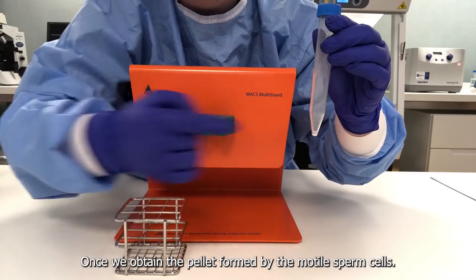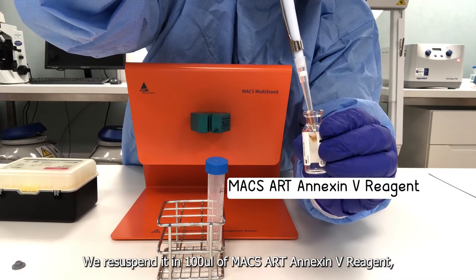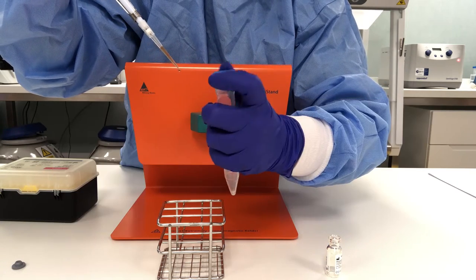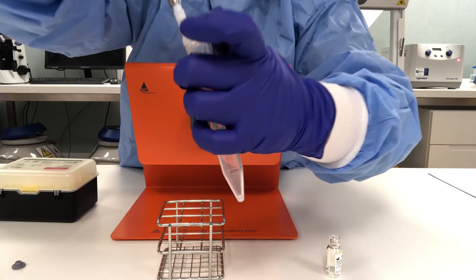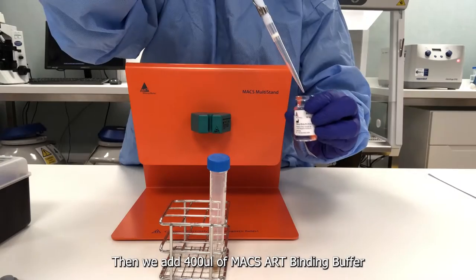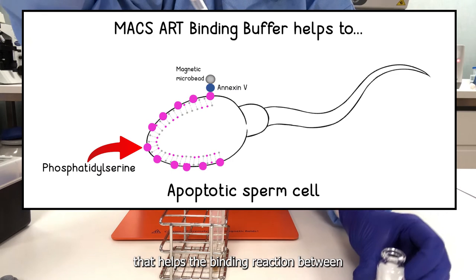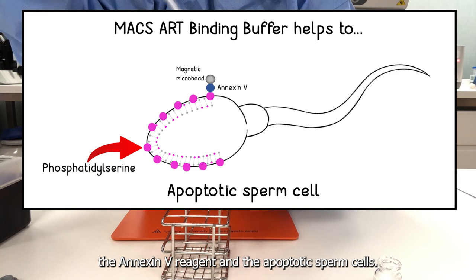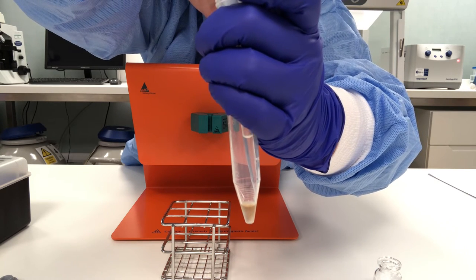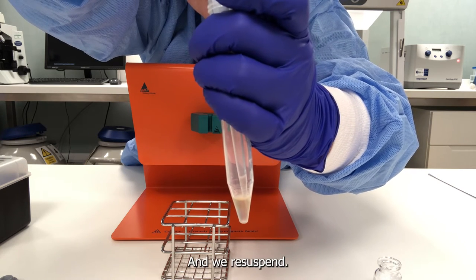Once we obtain the pellet formed by the motile sperm cells, we resuspend it in 100 microliters of MACS-ART Annexin-5 reagent, which consists of magnetic microbeads conjugated to Annexin-5. Then we add 400 microliters of MACS-ART binding buffer that helps the binding reaction between the Annexin-5 reagent and the apoptotic sperm cells. And we resuspend.